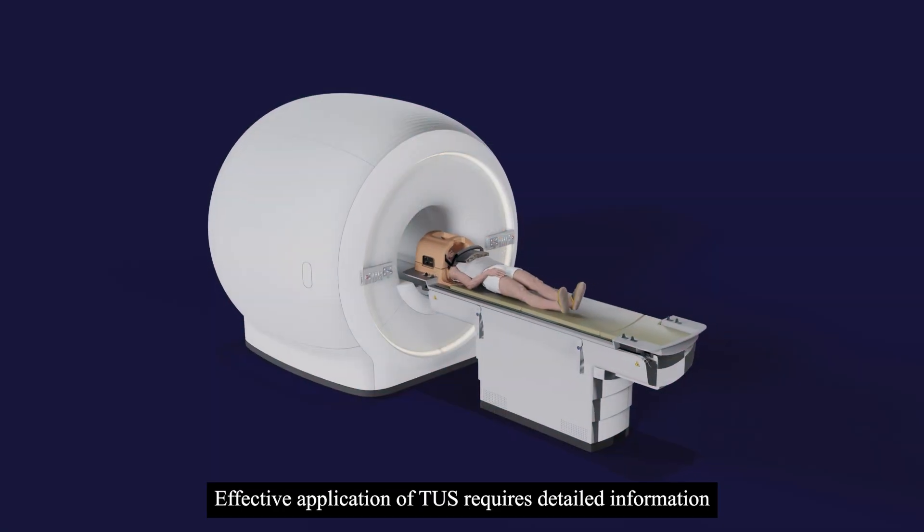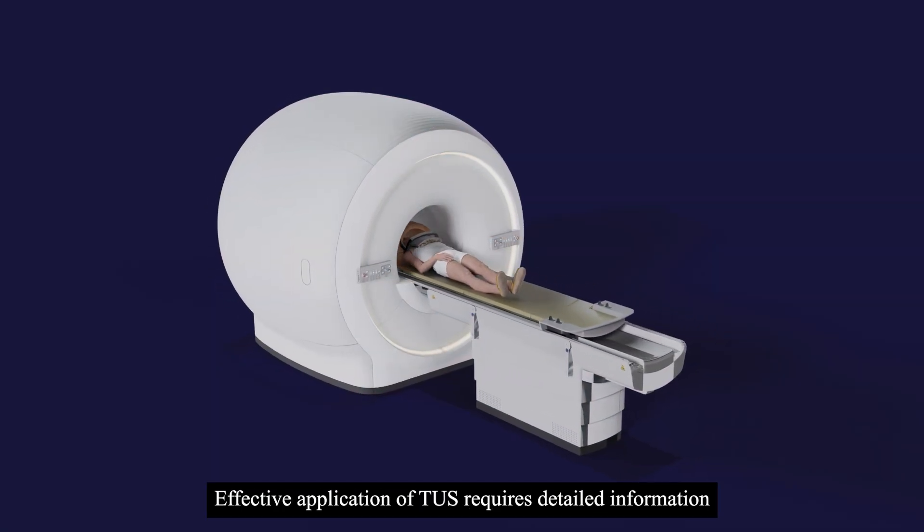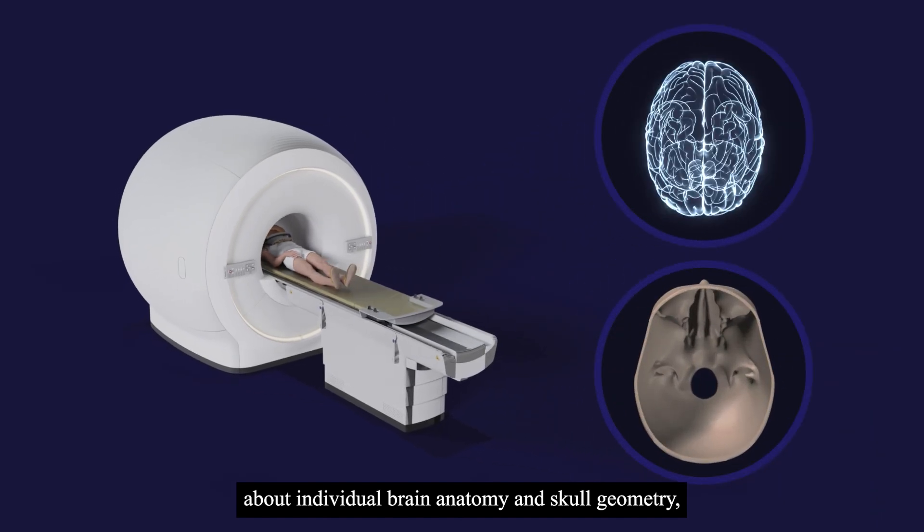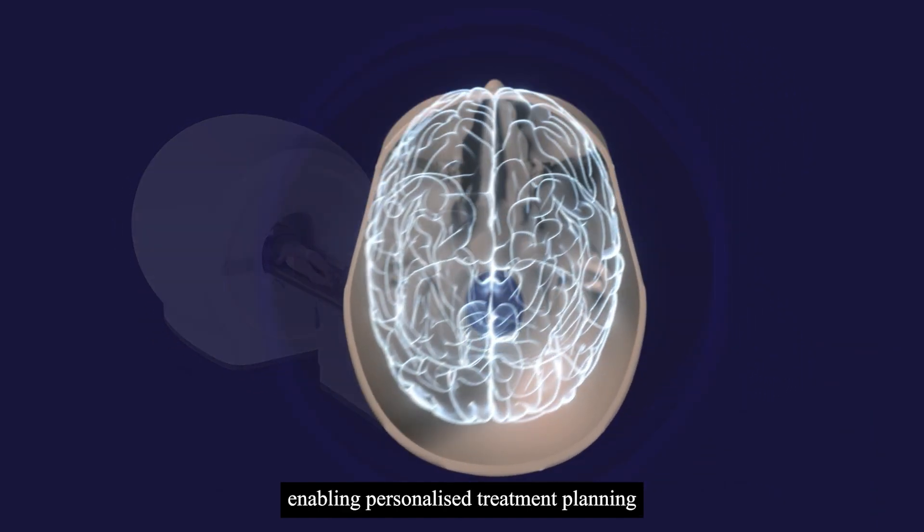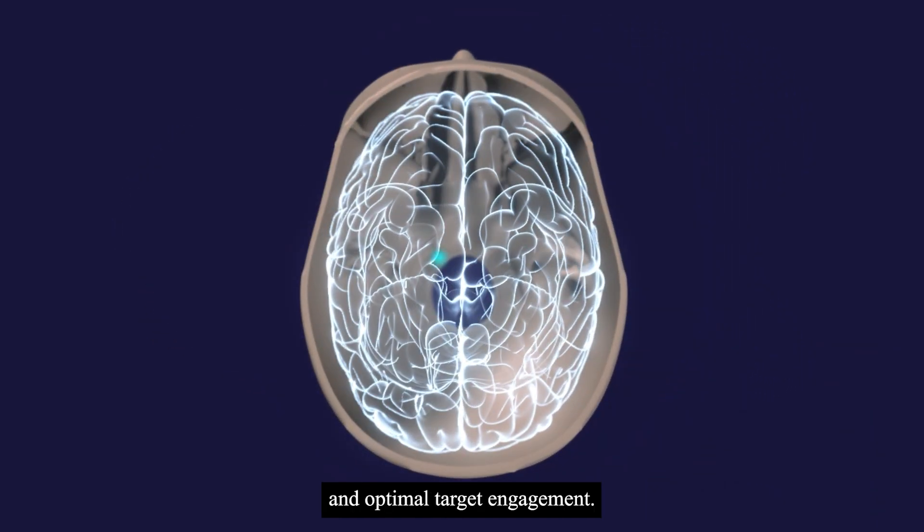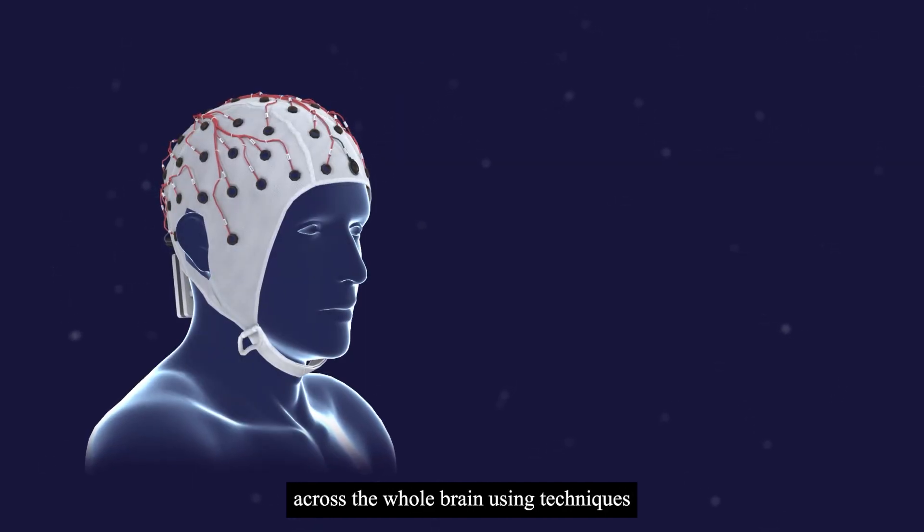Effective application of TUS requires detailed information about individual brain anatomy and skull geometry, enabling personalized treatment planning and optimal target engagement.